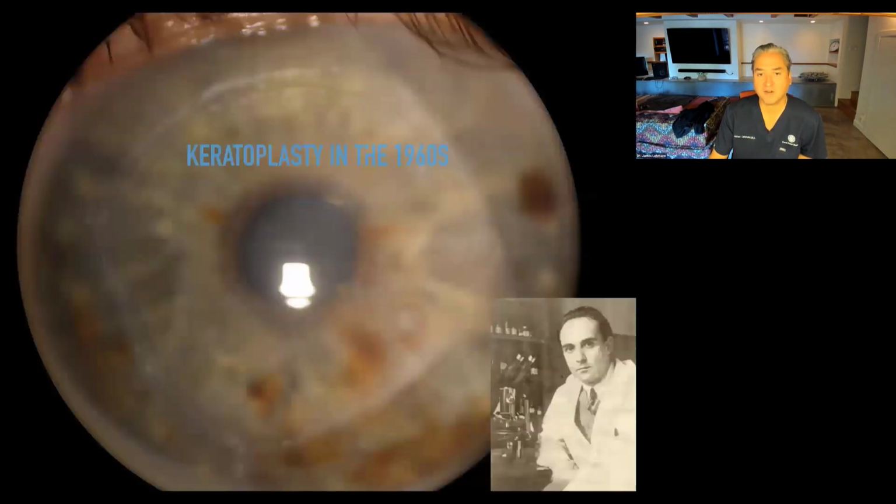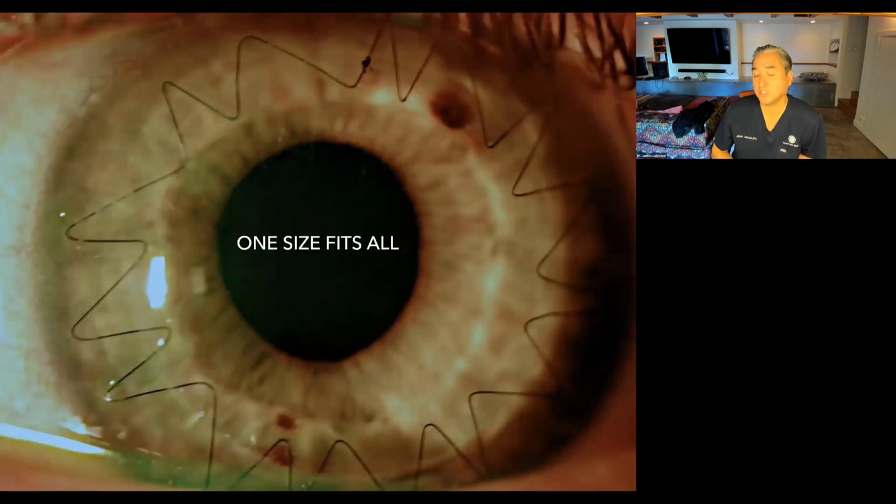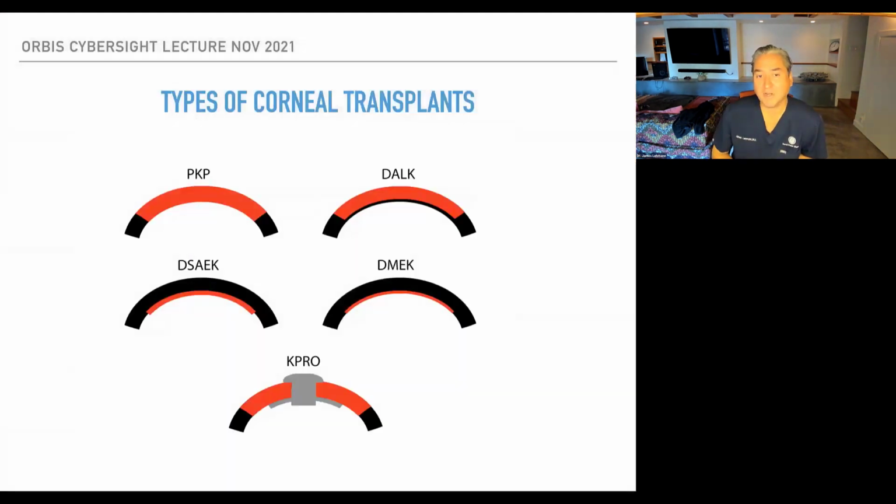So just a little bit of background. Penetrating keratoplasty has been done for hundreds of years, but it didn't get really done in earnest until the 50s and 60s, started in New York with Dr. Castroviejo. And this is a graft where they used a double-bladed knife and made a square type transplant. This is from an actual patient that I saw years later. And for a long time, it was just one size fits all. Every patient that had corneal pathology that was bad enough to need a transplant would end up getting a PK. And now we know that's not the case.